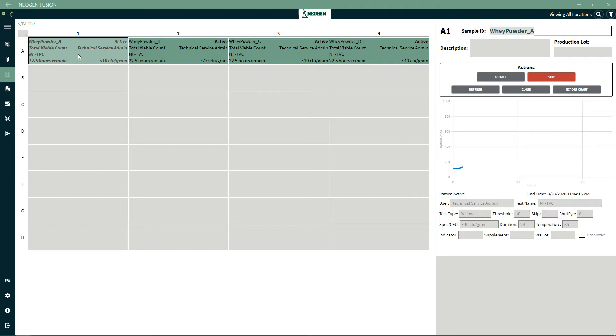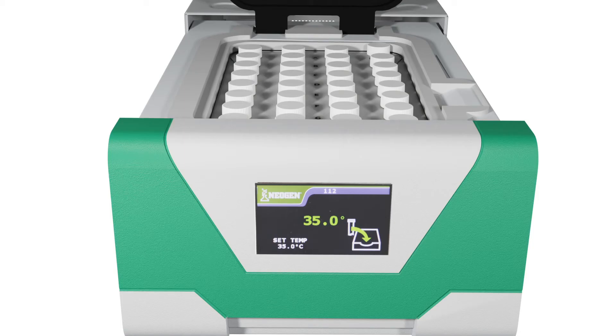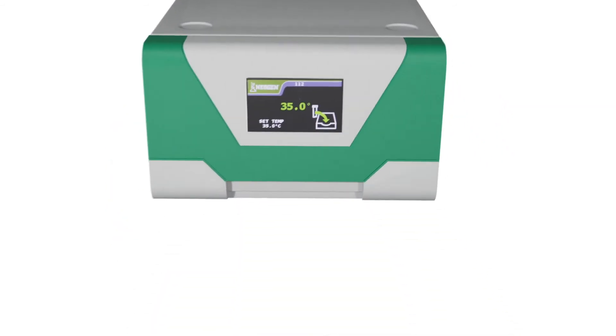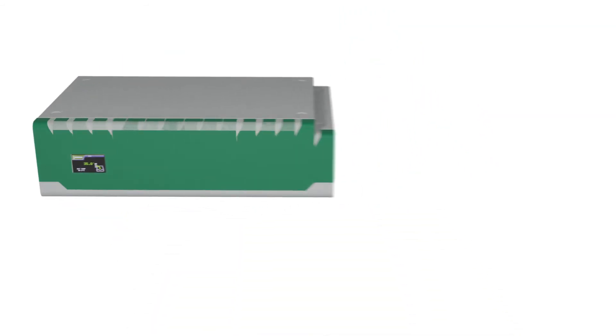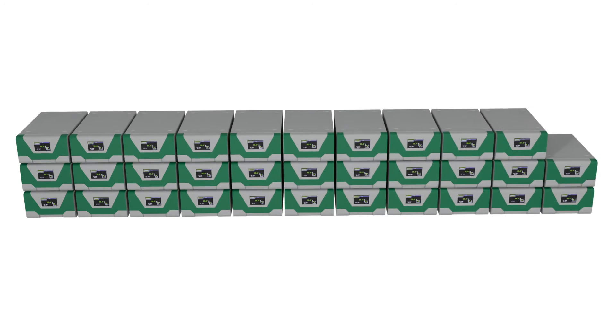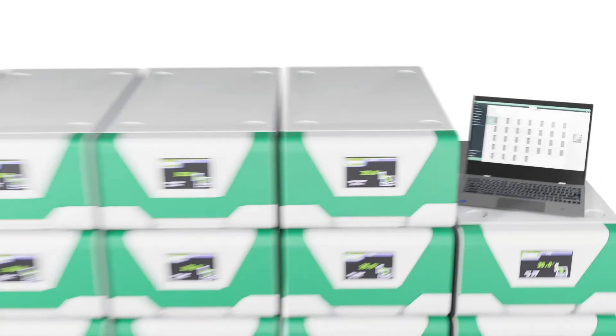The instrument measures the optical properties of the plug window every six minutes. Each Soleris unit holds 32 vials per drawer. A single software package can monitor up to 32 drawers, which means that users can run up to 1024 samples simultaneously.